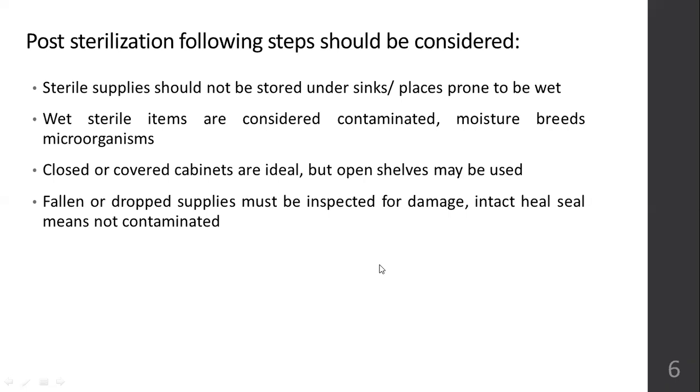Wet sterile items are considered contaminated. Do not use it, okay? If you see a water pool inside the sterile item, consider that as contaminated, okay? Because moisture will breed microorganisms. Cannot use it. Even if it is a recent moisture pool, you have to consider it as contaminated and give it back to the CSSD for re-sterilization.